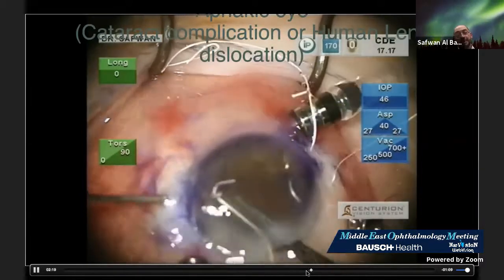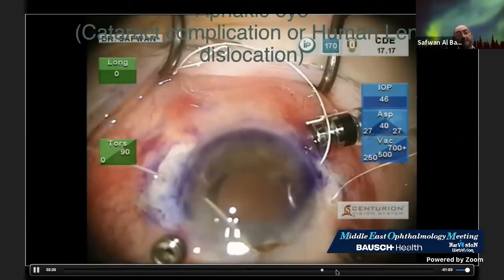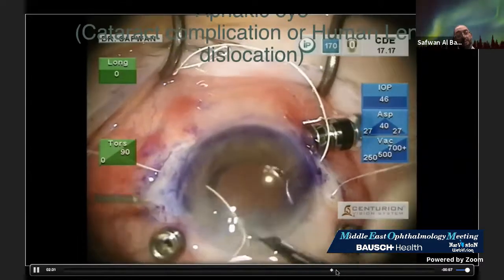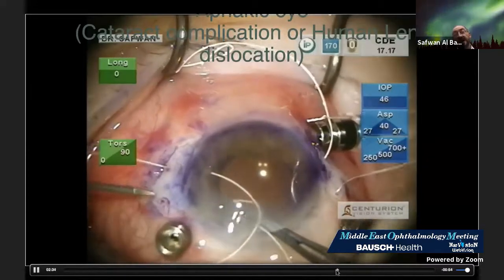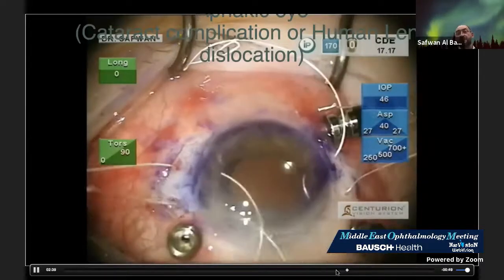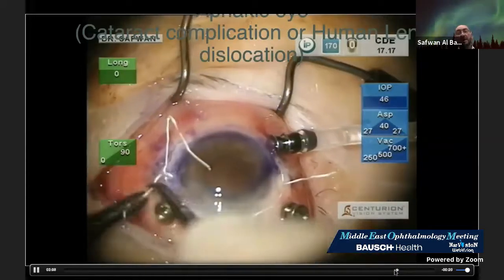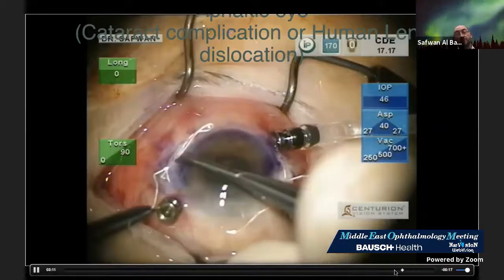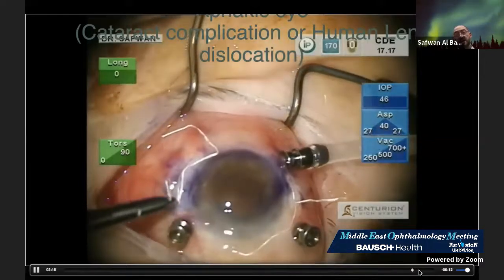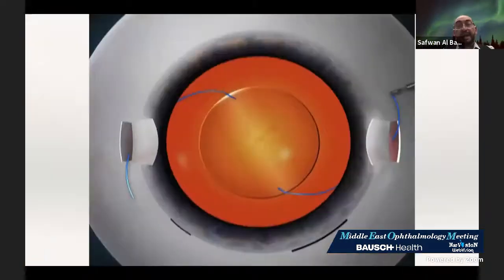Take the one tip from the eyelet and then go through the other sclerotomy, the other tip. Here, grasping the second tip through, see, by right hand, I can prepare the eyelet for the left hand forceps and grasp the suture outside, and then we will end up with the suturing of two ends, 1, 2, 3, tie knot, and then trimming the suture and burying the suture, and then close the conjunctiva.